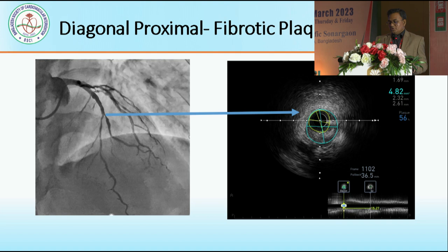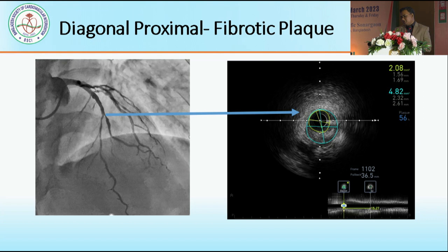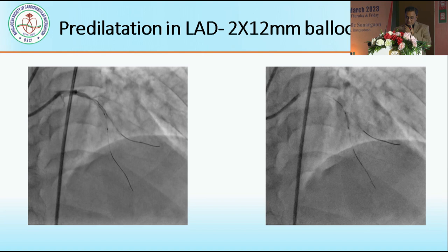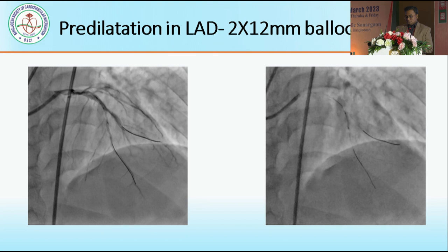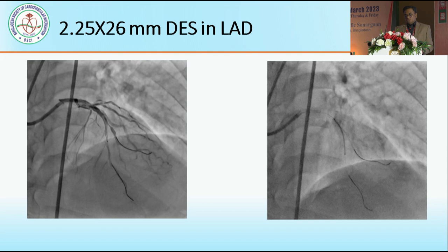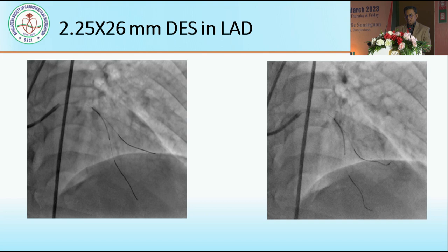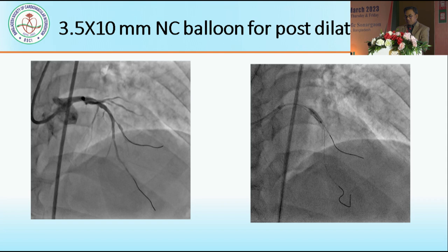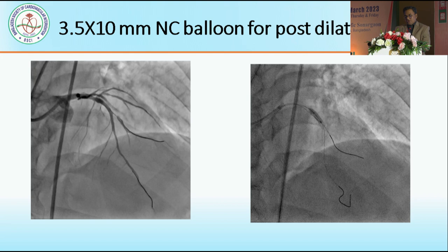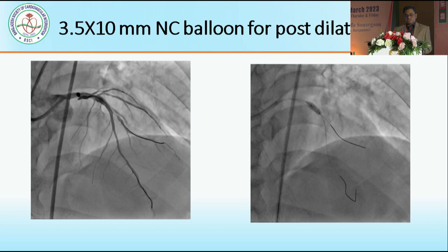We also did IVUS of the diagonal. The diagonal diameter is approximately 2.2 mm with 56% plaque burden. So, as planned, our single stent strategy involved pre-dilating the LAD with a 2 x 12 mm balloon, then placing a stent with IVUS-guided proximal and distal landing zones — a 2.25 x 26 mm drug-eluting stent in the LAD. Post-dilation was done with a 3.5 x 10 mm NC balloon, since by IVUS the proximal landing was almost 3.9 mm.